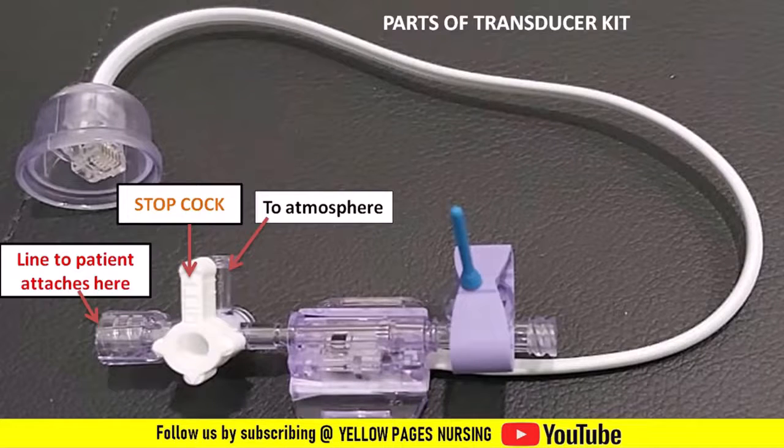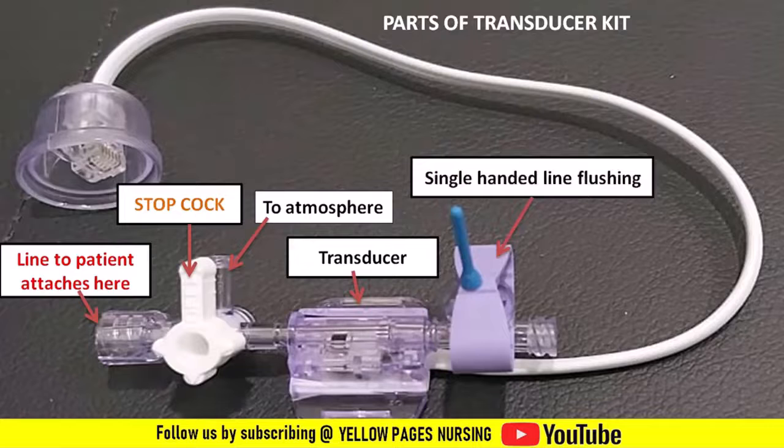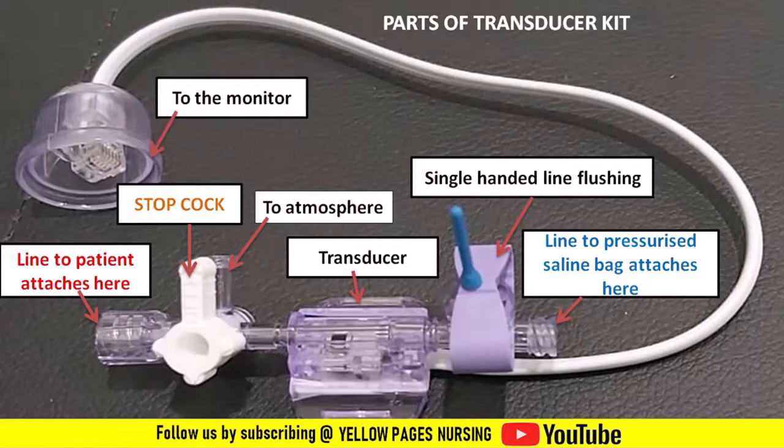Next to the stopcock is the transducer, and next to the transducer is the single-handed line flushing. Next comes the point where the pressurized saline bag is attached. And the white line which goes out is called the cable, and this is attached to the monitor. So this is all about the parts of the transducer kit.